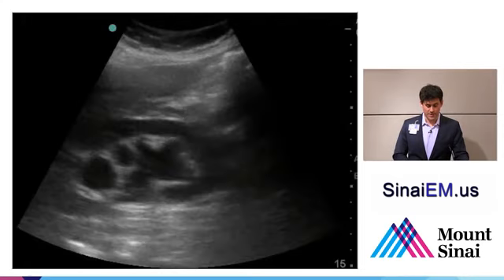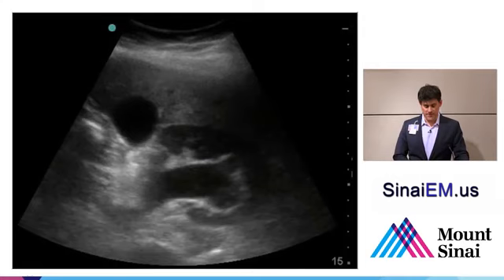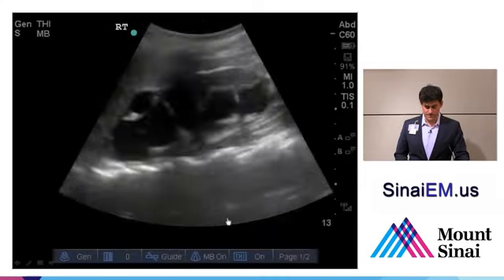And yet again, another example here where the dilated collecting system, you know, in certain scans through this structure, it would almost look like there's a multicystic component to it. So typically hydronephrosis is going to remain within the center of the kidney and push the rest of the architecture outwards. And here that same kidney through a transverse view, we can see this dilated collecting system and this almost horseshoe shape now of surrounding kidney.